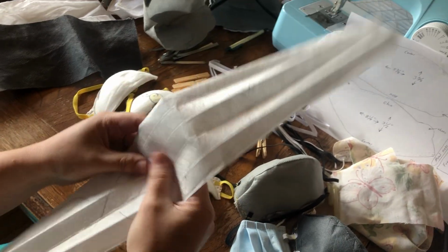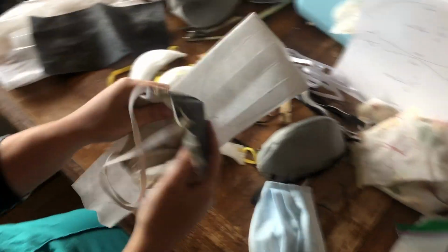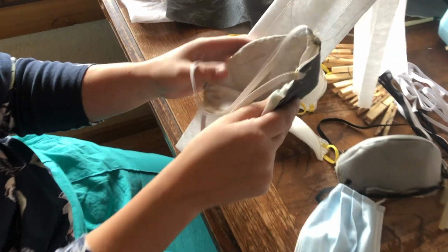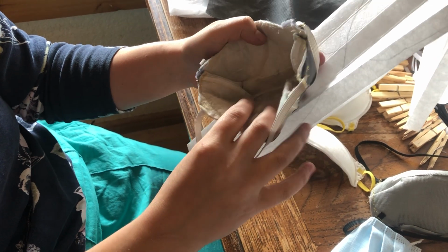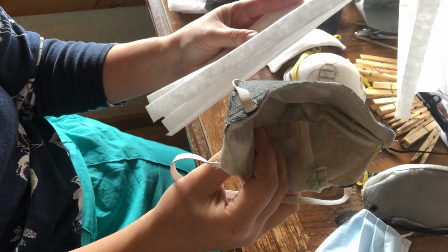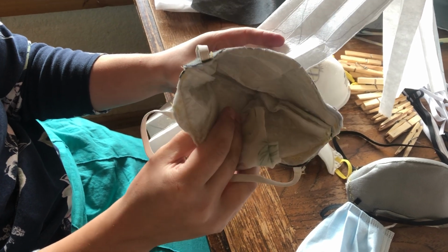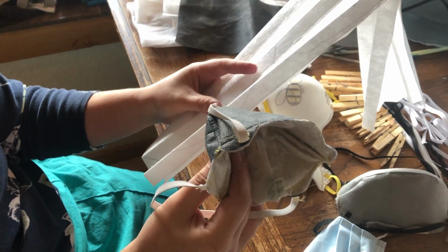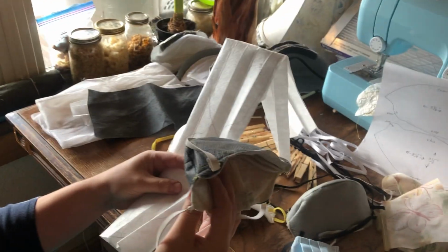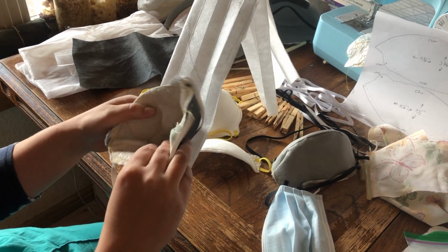So what I did was I pulled this filter apart, and you see it turns into fabric. This stuff, the first mask I made for myself, I put that in, so this has been through the wash. I wanted to experiment. It did not like the washing machine. It didn't like the dryer. The washer was fine. It holds up fine to water. It does not hold up fine to heat. In fact, I had stuck a piece in there that wadded up into what looked like a piece of saran wrap when it came out. So yeah, it can't handle the dryer. It can handle a little bit of temperature, but not much.